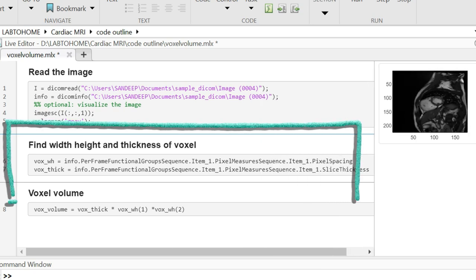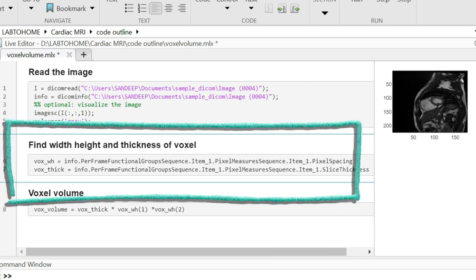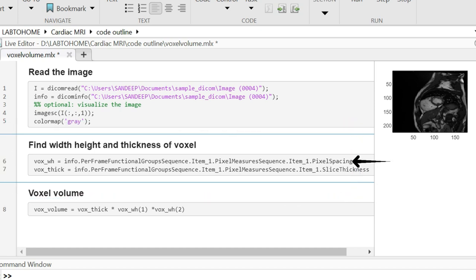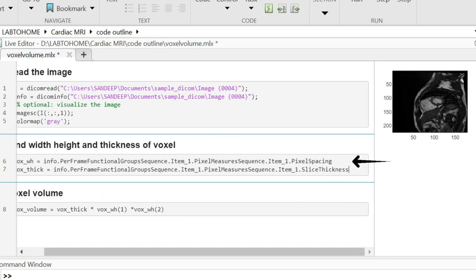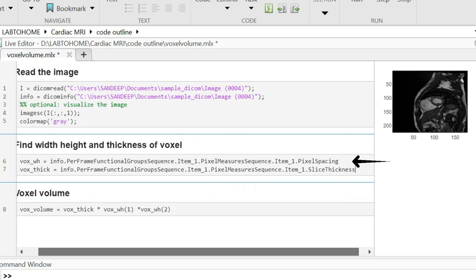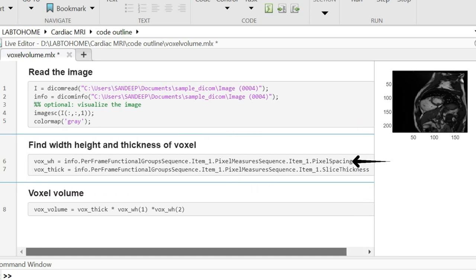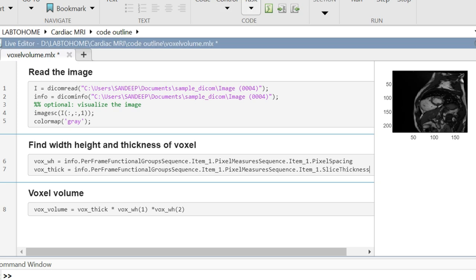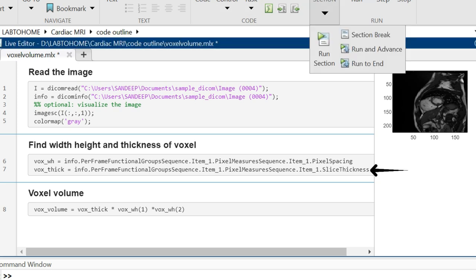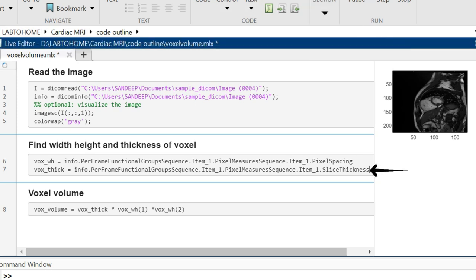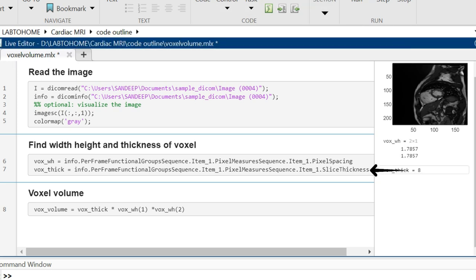We need to find the width, height and thickness of the voxel. This line of code extracts the width and the height of the pixel from the pixel spacing attribute, and thickness is obtained from the slice thickness attribute.